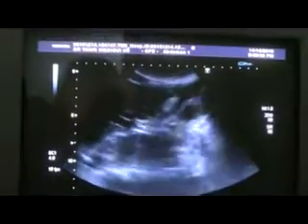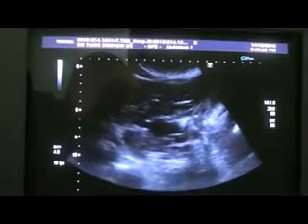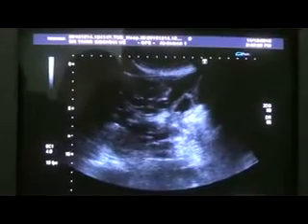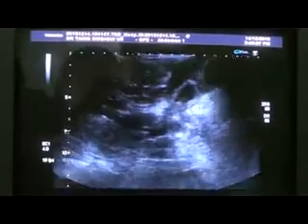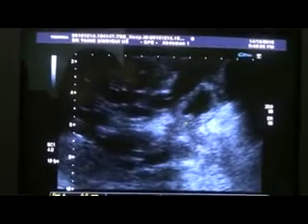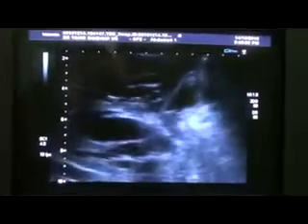This is the gallbladder, and we do see a calculus within it along with sludge. There is sludge within the gallbladder. And here you can see sludge in the dilated CBD.